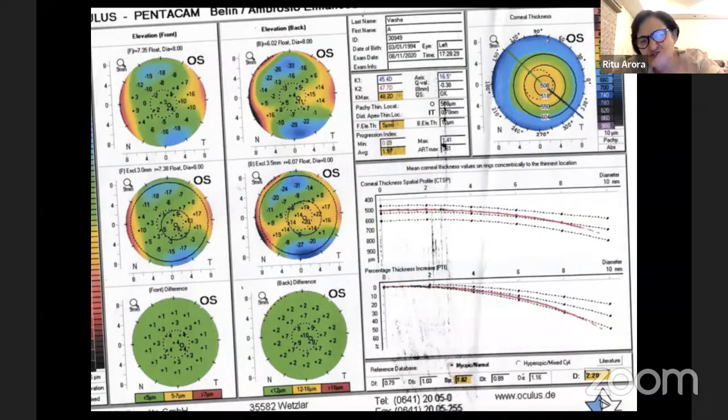So that doesn't matter. Suppose this patient is -2 diopter, -1.5 diopter sphere, -1 cylinder. The patient is very insistent, I want to undergo LASIK. I'm just giving you a hypothetical situation, but it does happen. And it's fitting very much within my criteria of residual stromal bed. So if you were to take this patient for LASIK, what will happen to the flap?